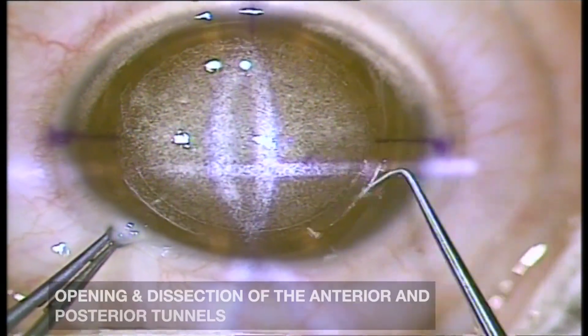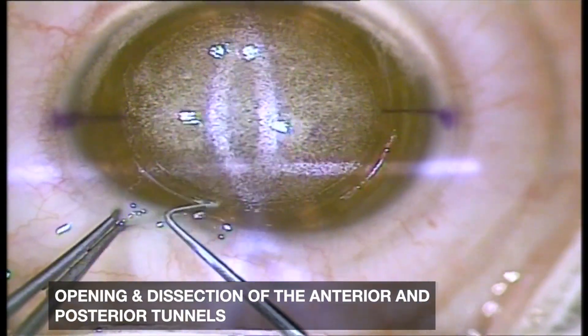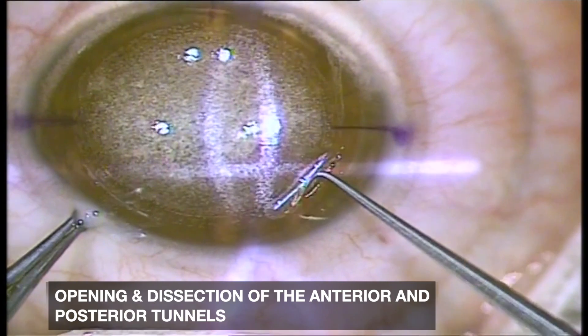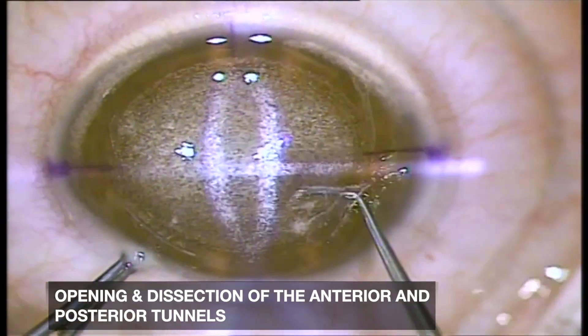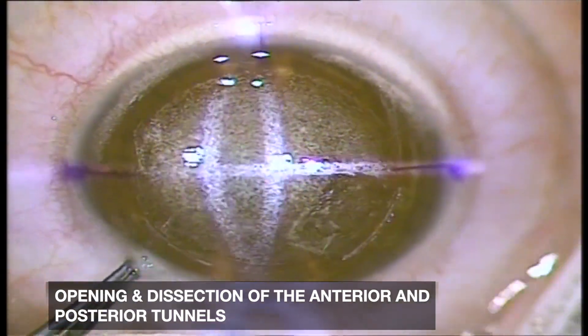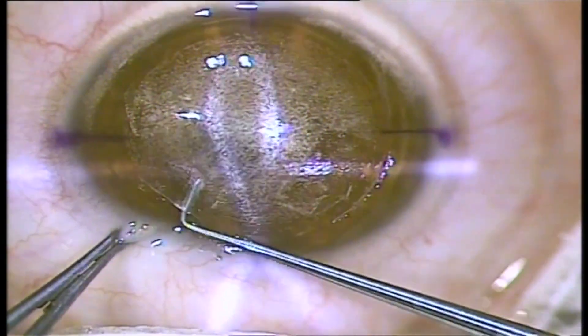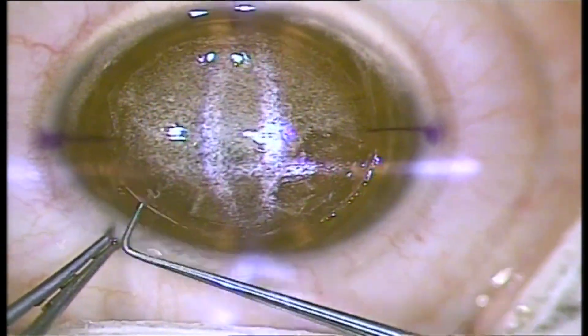The anterior and posterior tunnels are opened. This is helpful for surgeons early in their learning curves. More advanced surgeons can create the second incision and keep it as a safety net, while others might choose to create only one incision.